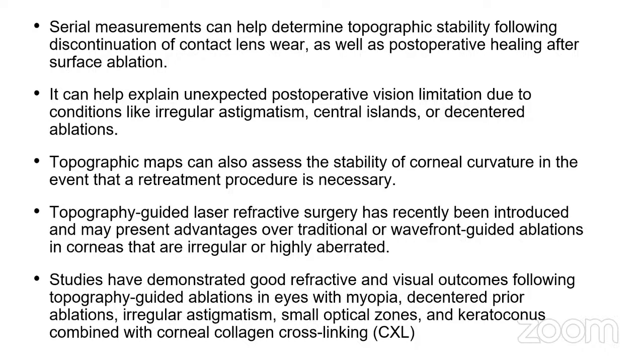Topography-guided laser refractive surgery has recently been introduced and may present advantages over traditional or wavefront-guided ablations in corneas that are irregular or highly aberrated. Studies have demonstrated good refractive and visual outcomes following topography-guided ablations in eyes with myopia, decentered prior ablations, irregular astigmatism, small optical zones, and keratoconus combined with collagen cross-linking.